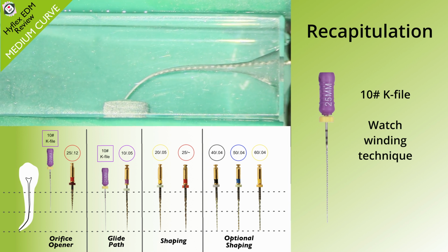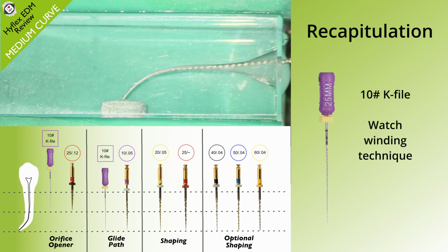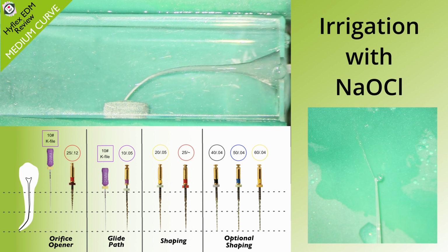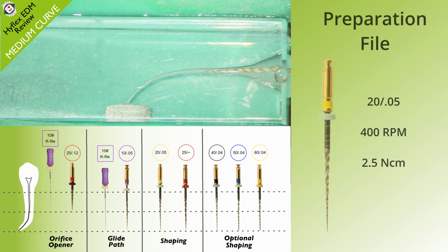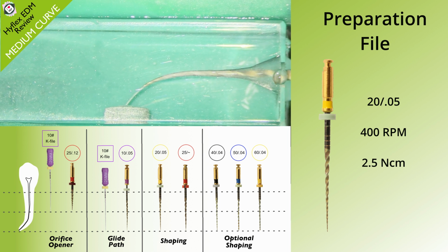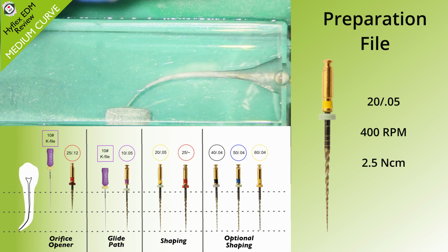If you don't get to length, a little bit of irrigation, a little bit of recapitulation with a size 10 file, make sure you get all that debris out. Much more challenging than the simple case. More irrigation.